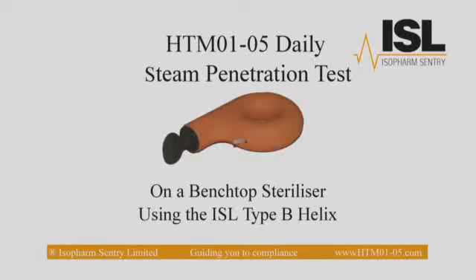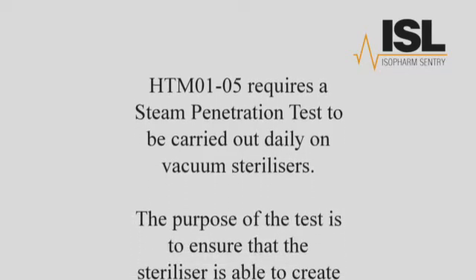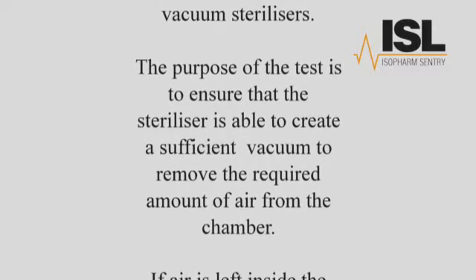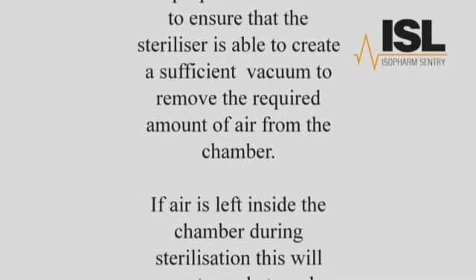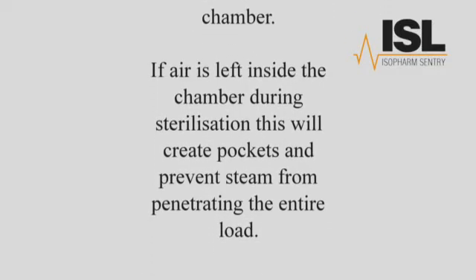HTM 01-05 Daily Steam Penetration Test on a benchtop steriliser using the ISL Type B Helix. HTM 01-05 requires a steam penetration test to be carried out daily on vacuum sterilisers. The purpose of the test is to ensure that the steriliser is able to create a sufficient vacuum to remove the required amount of air from the chamber. If air is left inside the chamber during sterilisation, this will create pockets and prevent steam from penetrating the entire load.